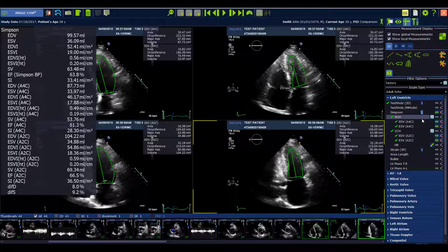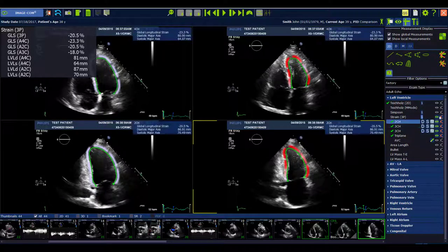The auto tools work as before. The change in Auto LV is that we have removed the measurement for GLS in two-plane. In Auto Strain, we have also removed all the volume measurements — the end-diastolic volume, the end-systolic volume, the stroke volume, and ejection fraction. However, we have added some new measurements: the length of the ventricle in systole and diastole for the two-chamber view and the four-chamber view.